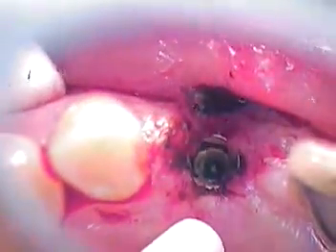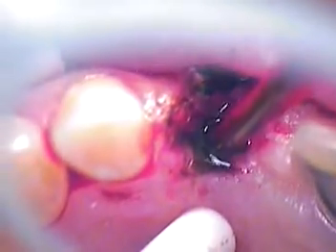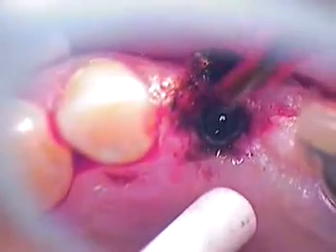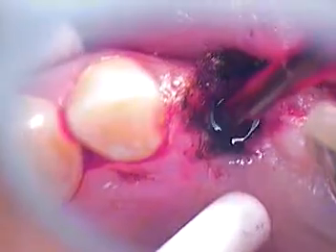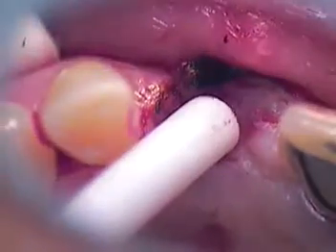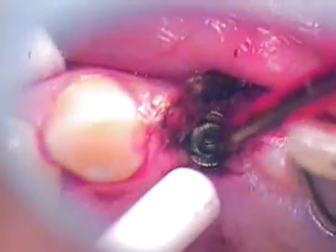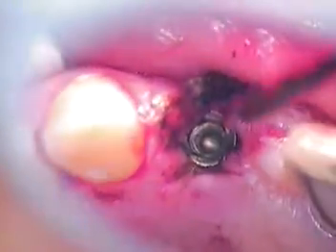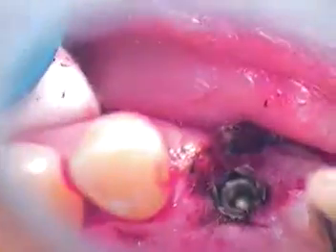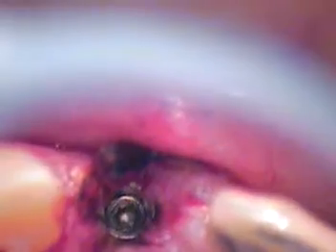And that's next. Right now we have a 2-ply cord from ginger pack surrounding the site, so we're keeping that tissue out of the way. How are we doing? Okay? All right. Suction in there again. Okay. That's good. Now let's move on to smaller suction and try to keep the coagulum under control.